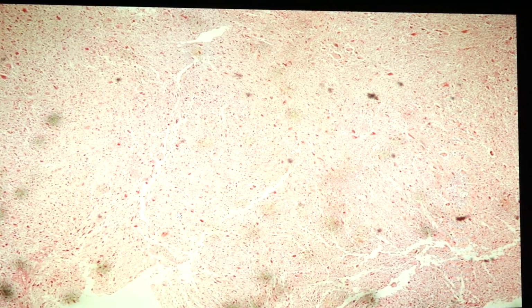Next is slide 23. This is rhabdomyosarcoma. If you look at it in high power magnification, you would already see the presence of large cells. Rhabdomyosarcoma is a malignant tumor that would arise from skeletal muscle. That's why it's called rhabdo.